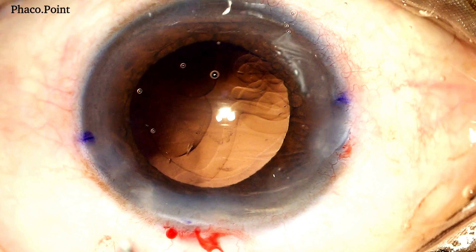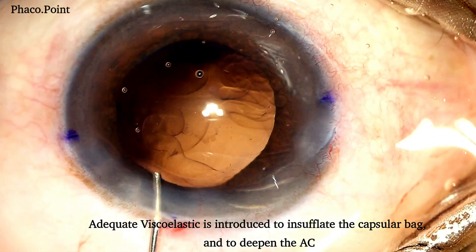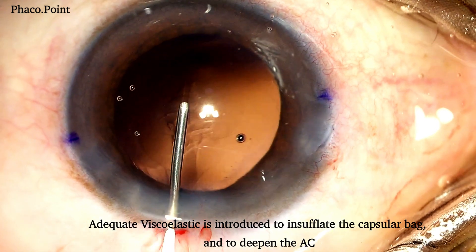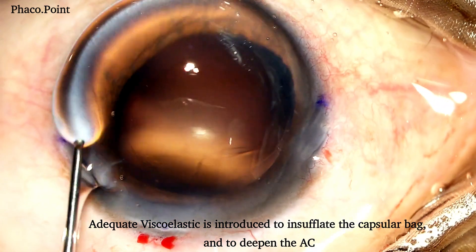Following the nucleus management and the removal of the cortex by bimanual irrigation aspiration, and prior to the introduction of the IOL in the capsular bag, it is imperative to inject adequate viscoelastic both in the anterior chamber as well as in the capsular bag, with a view of insufflating and expanding it.